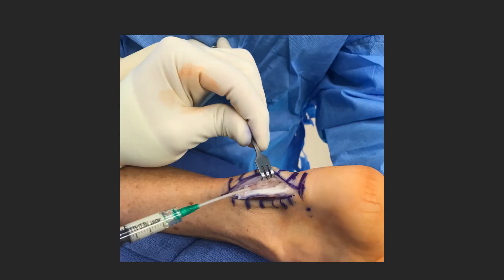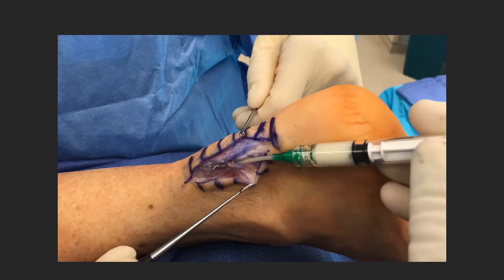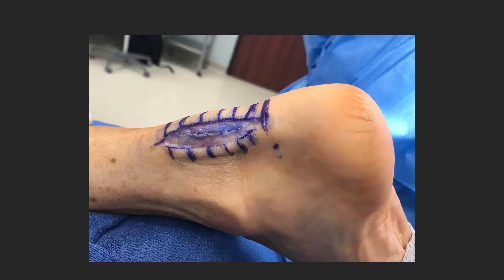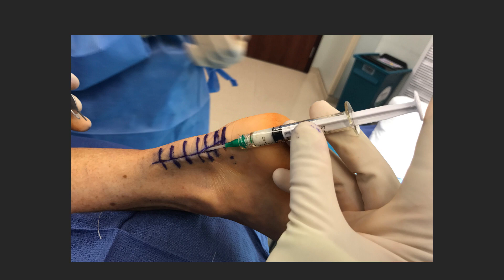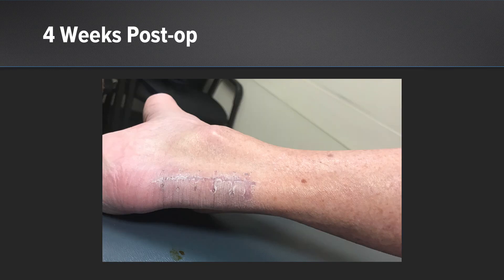We then injected that deep within the repair and closed the tendon over the top, as you can see here. We then performed a peritenon repair, and in between that peritenon and the tendon, because of the interdigitating nature of the flowable Interfill, it was able to fill in that gap. You can see the peritenon closure there, and then in between the deep dermal closure and the peritenon. This is how she looked at seven days, then at four weeks, and ultimately she proceeded to return to her normal function without any issues with that Achilles.